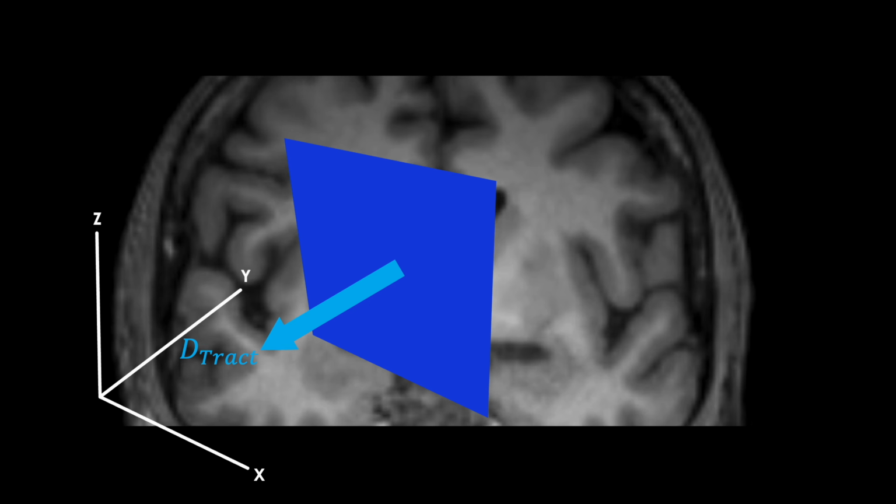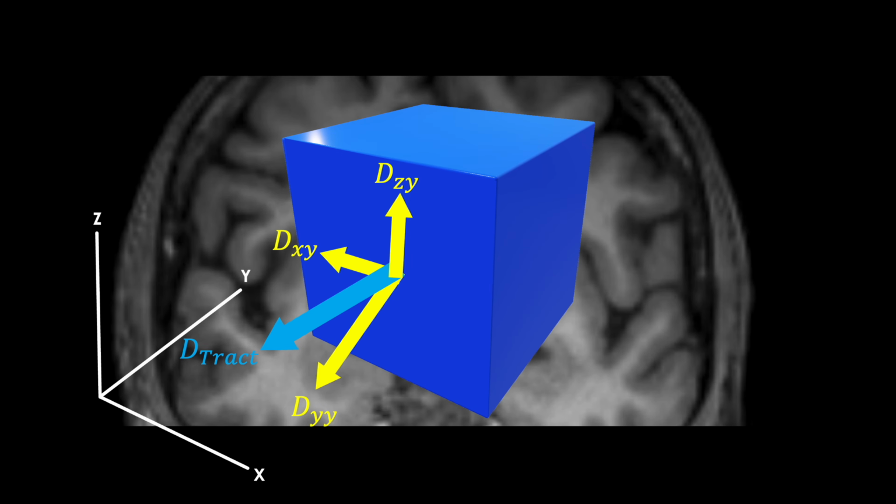To describe this in 3-dimensional space with respect to this surface, we'll again have a component perpendicular to the surface along the y-axis, dyy, again meaning along the y-axis of the surface y, as well as 2 components parallel to the surface y, dxy along the x direction of the surface y, and dzy along the z direction of the surface y. 2 down, 1 more to go.